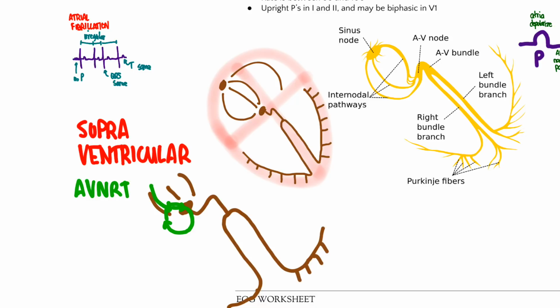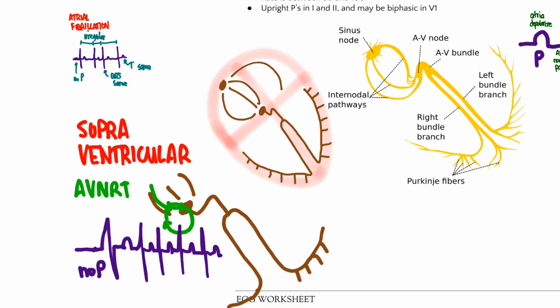And what you're going to see again is, are we going to see P waves? Do we have depolarization of the atria like we normally do? No, we don't. So we're not going to see the normal P wave. So we're going to see no P, right? Are we going to have a normal QRS? Do we have travel through this His-Purkinje system as we normally would? Yes, we do, right? Because it's eventually going to go through here. And so we will have a normal QRS there and perhaps a T. Now, what happens with these cycles is they tend to go pretty fast because you're bypassing some of that blocking. And so you get QRST, QRST, QRST, QRST. Again, no P, but we do have the QRSs, and we do have the T waves.